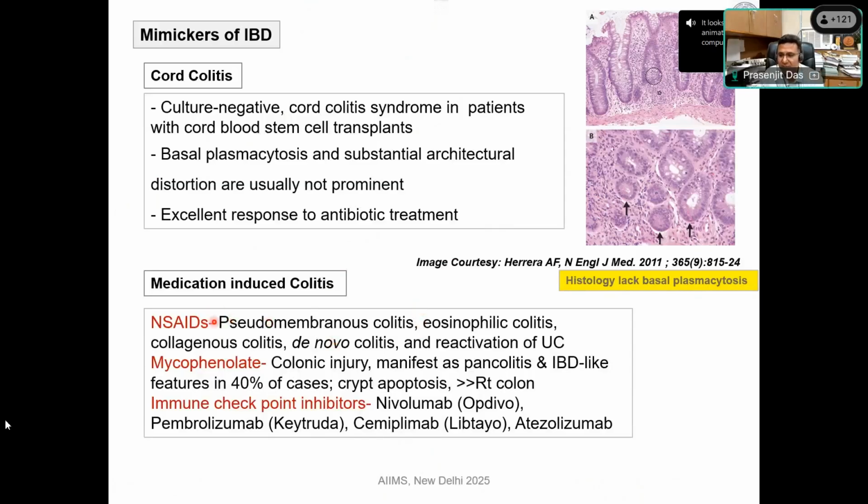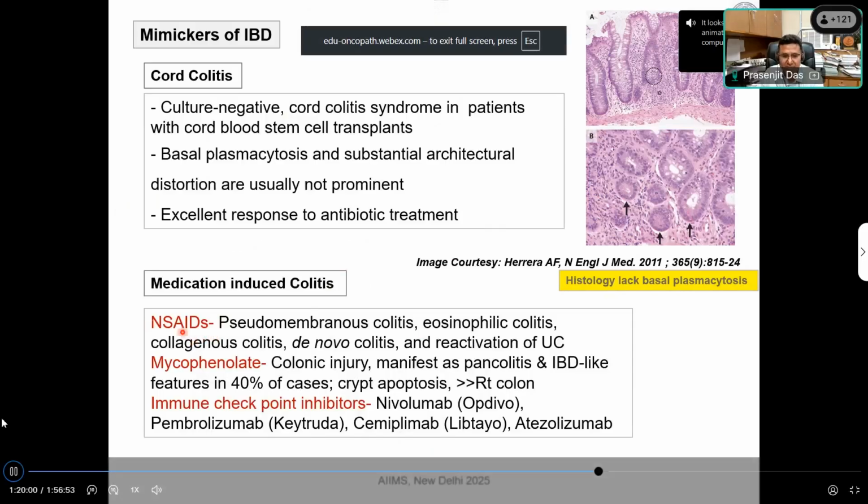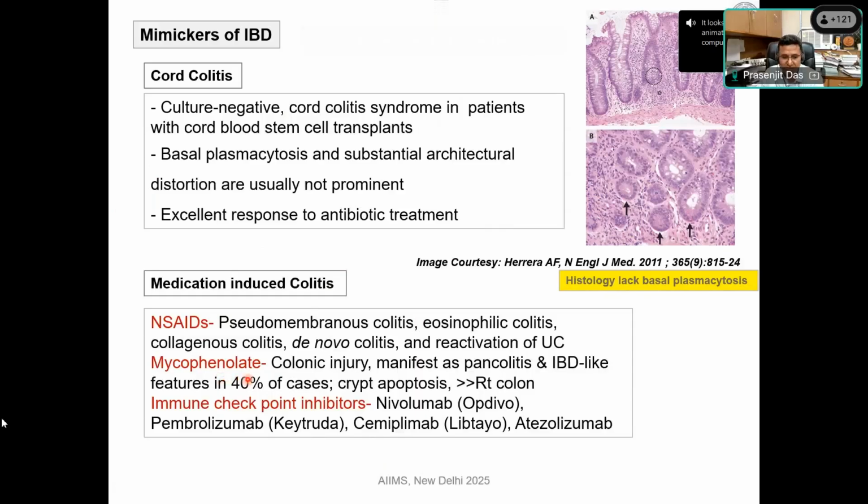Very commonly NSAID-like or IBD-like features can be seen because of chronic NSAID intake or MMF intake, or nowadays because of immune checkpoint inhibitor therapy. In all of them you can see a lot of neutrophilic infiltrate, lymphoepithelial lesions, some distortion. So these are common findings. Please remember all these differential diagnoses, and with that I will go into the next one.